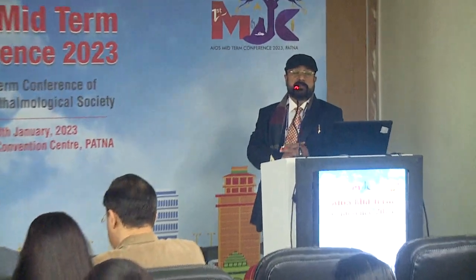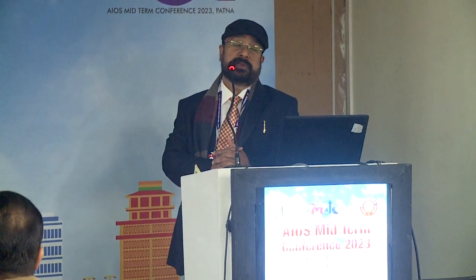The most dreaded complication of the intumescent white cataract is the Argentinian flag sign. A lot of people have described a lot of ways, and I also tried a lot of ways. We started with the spiral capsulorhexis, and then putting a 26 gauge needle and sucking out, milking out the capsular matter and the cortical matter.